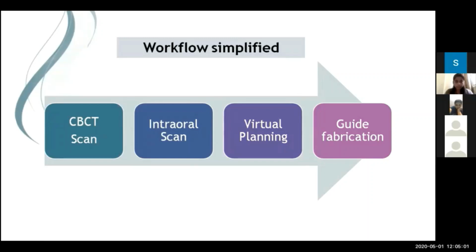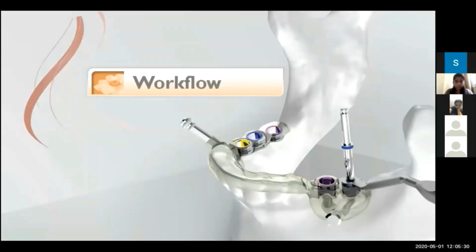So we'll not be discussing the implant surgical aspect too much in detail today. Rather, we will focus on how to go about this particular workflow until the point of the guide fabrication. Both these presentations will be done simultaneously by me and Dr. Swapnil, my colleague. We will start first with the CBCT scans and the intraoral scans, and then the actual virtual planning and the merging of these scans, etc., will be shown to you live by Dr. Swapnil. So let's go about dealing with the workflow of the CBCT scan.